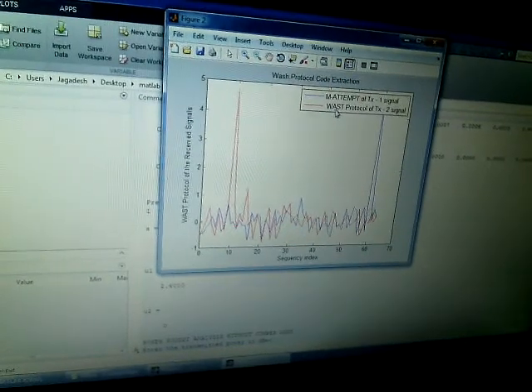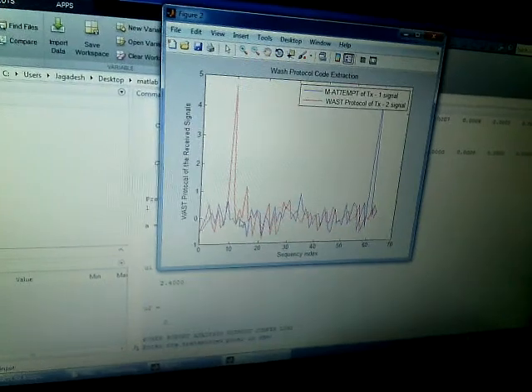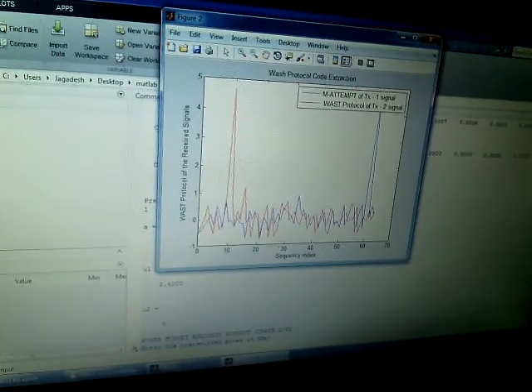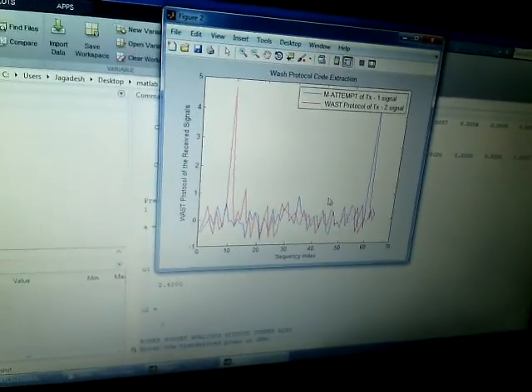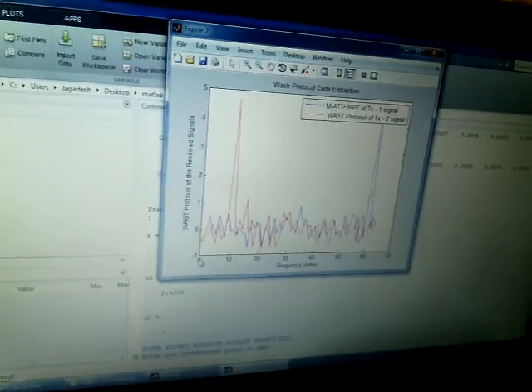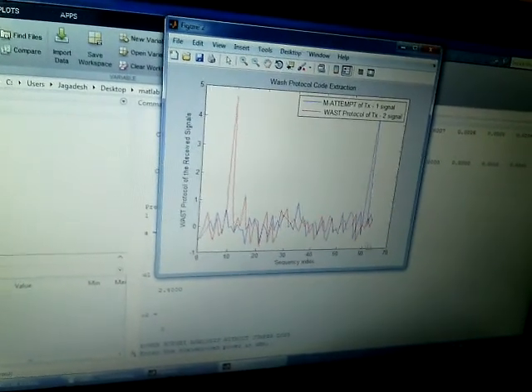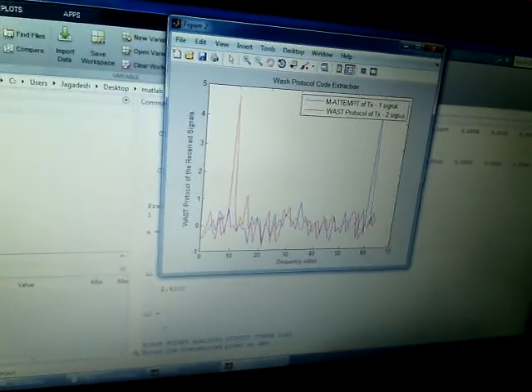WAST is the wireless autonomous spanning tree protocol, the parent and child relationship of data that can be sent and received, and collisions or traffic can be avoided using the WAST protocol. M-ATTEMPT is continuous monitoring. So we enter 0 to 60 as the number of patients entering the hospital, and the wave starts in red.